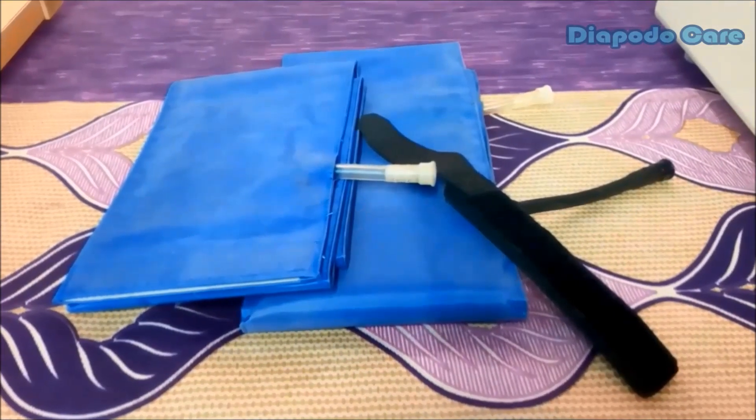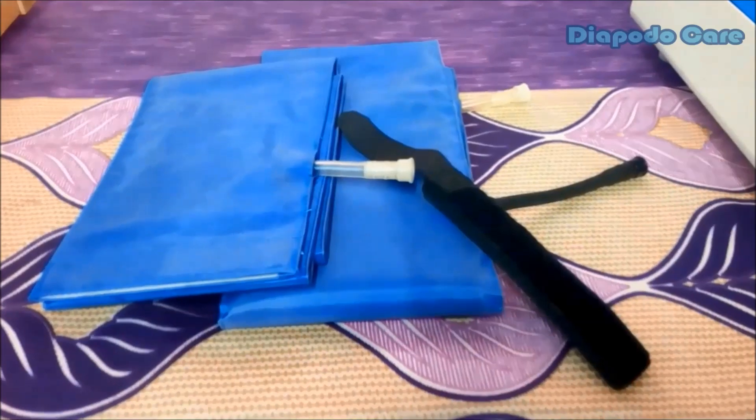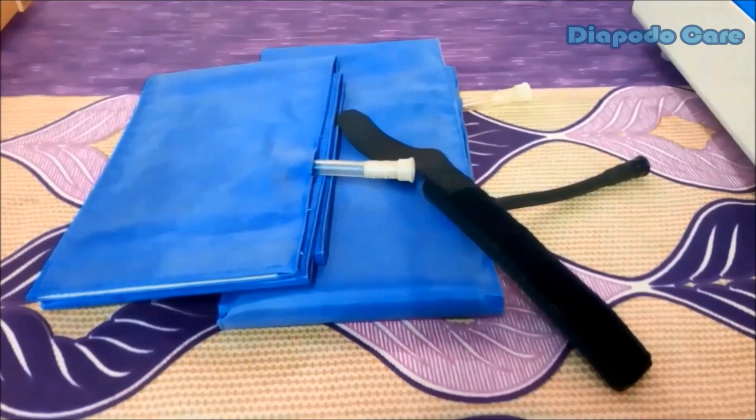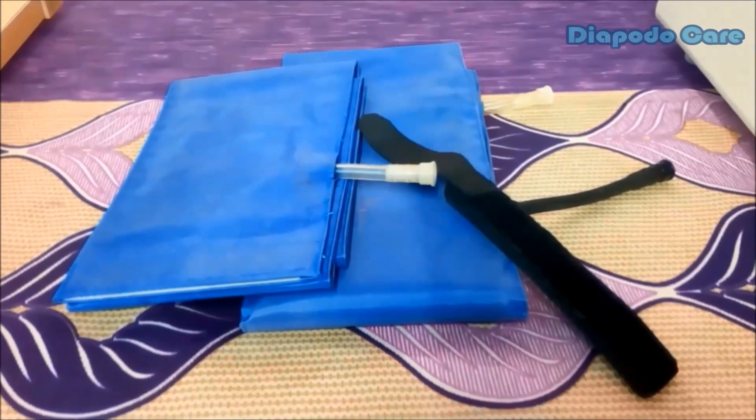Along with the machine, we will provide two different sizes of blood pressure cuffs. The long adult size pressure cuff is for ankle and brachial pressure measurements. The small black colored cuff is for toe pressure measurement.